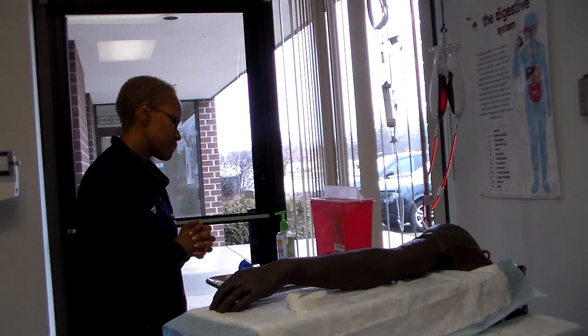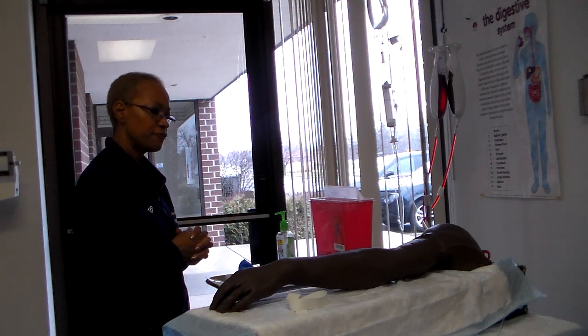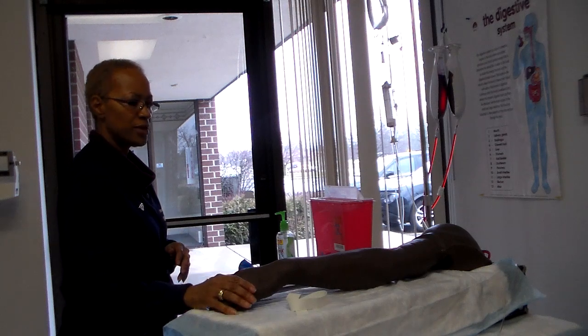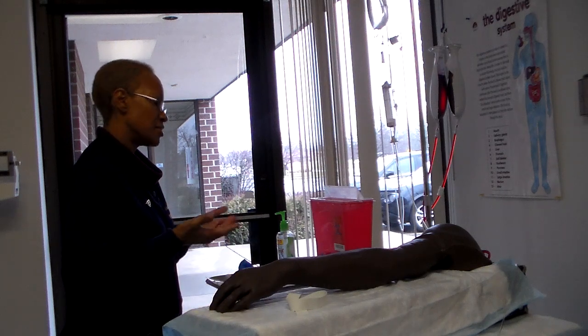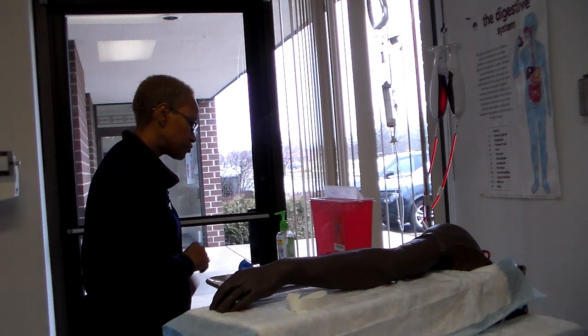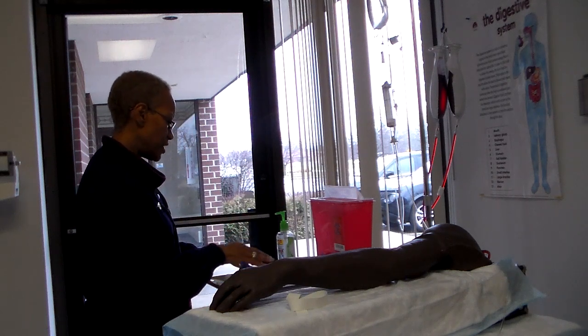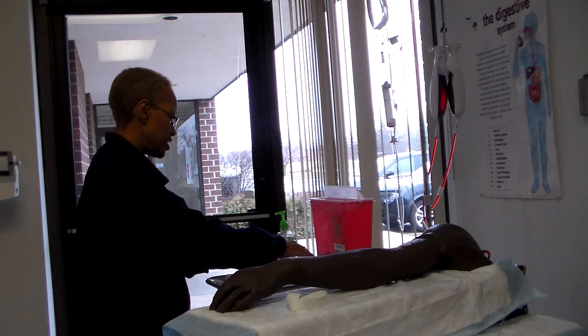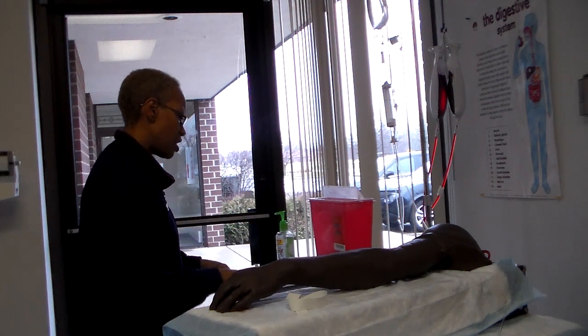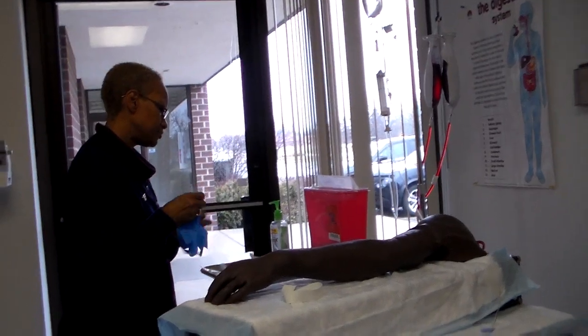Okay. Make sure your client is comfortable. Also, it needs to be comfortable for you, so you want to make sure that the bed is up at a good working height for you. Save your back, remember. Organize your equipment, so you want to make sure that you have everything at the bedside and it's all organized. Make sure your lighting is good.